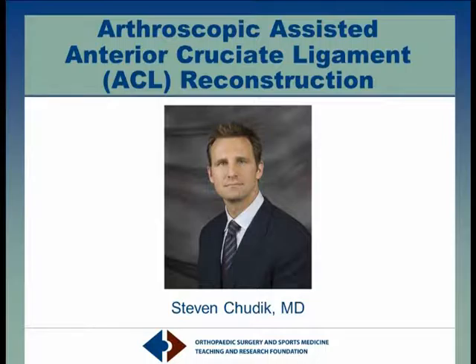Arthroscopic anterior cruciate ligament reconstruction, or ACL reconstruction, is a minimally invasive surgical procedure that I use to reconstruct a torn ACL in the knee. Using small arthroscopic incisions, I can replace the torn ACL, restore stability to the knee, and allow patients to return to full activity.